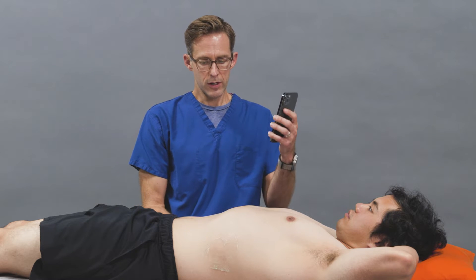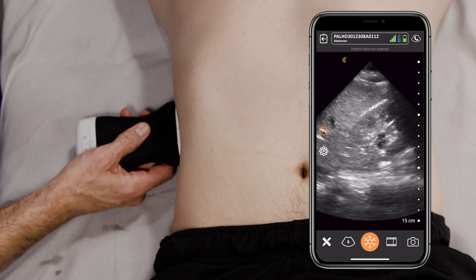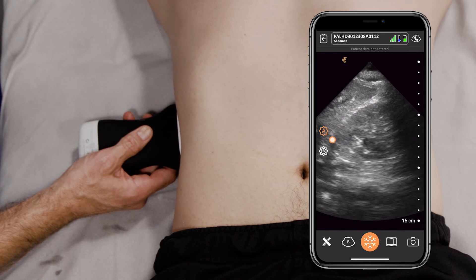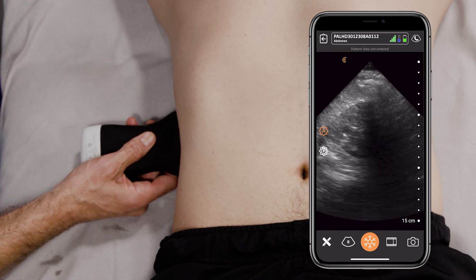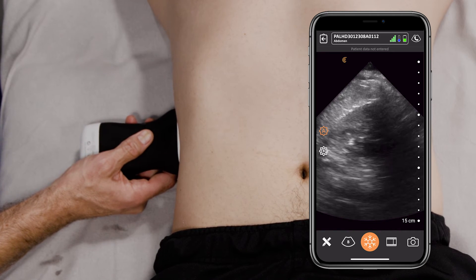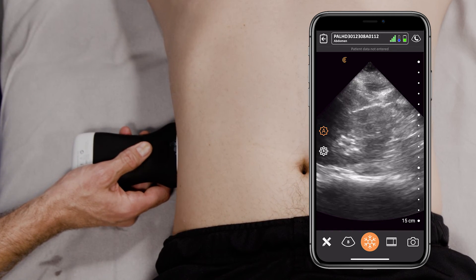Same thing — what we're trying to do is a longitudinal view, almost like a FAST view. Instead of focusing on the liver, which you see here, we're focusing on the kidney. And once again we're seeing some rib shadow, which is okay. We're looking for the renal pelvis. Sometimes it's harder to view because of respiratory variation. Sometimes we can have the patient take a deep breath and hold it, to try to get away from those rib shadows, like we're seeing right now.